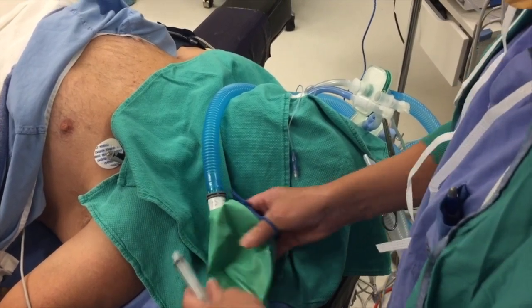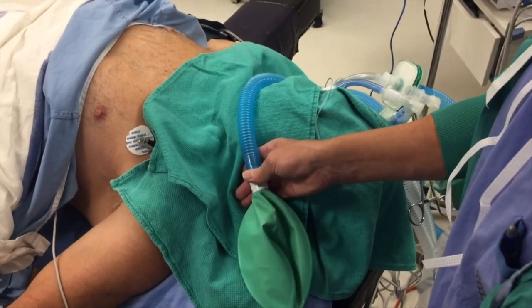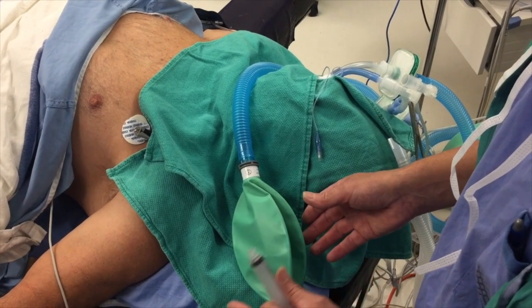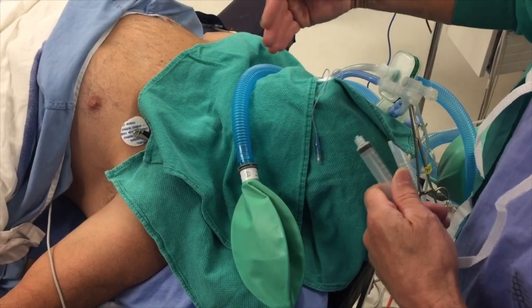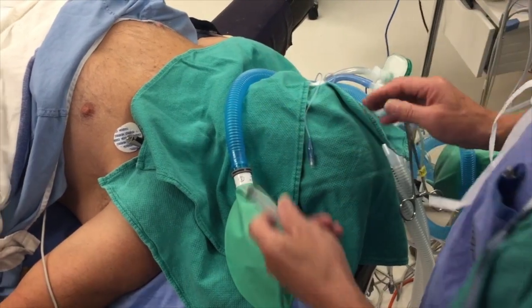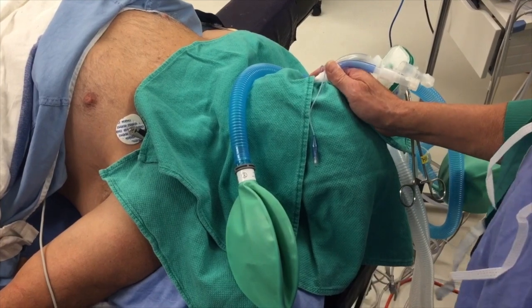Now I'm going to empty the bag again, so I just want to show us something here. We see that the bag moves with ventilation. It's filling up and then collapsing. Filling up. Air is not accumulating in the bag. That's because what we're observing is the effective ventilation pushing air in and out of the lung that we are not ventilating.